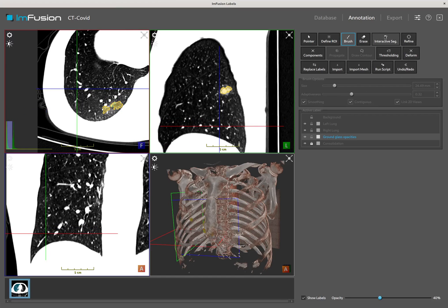Of course, there are many other tools besides the brush that are available. However, ImFusion Labels aims to be generic software for image segmentation and not all tools may be adapted to all use cases. It is often a matter of finding which tools are adapted to a specific task.